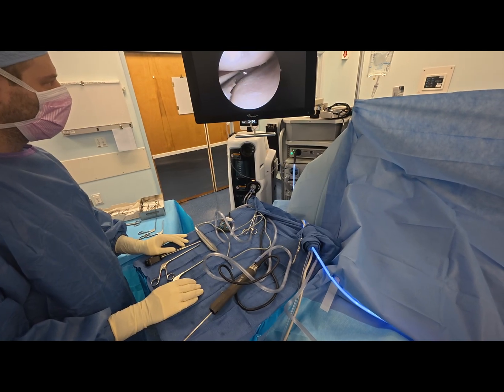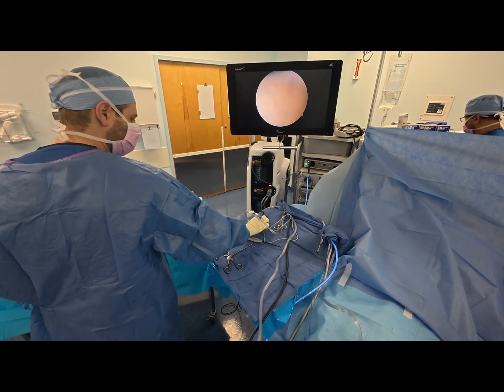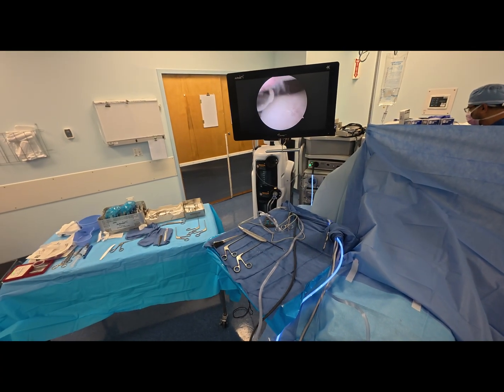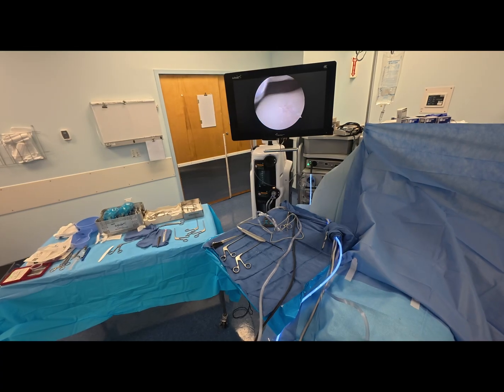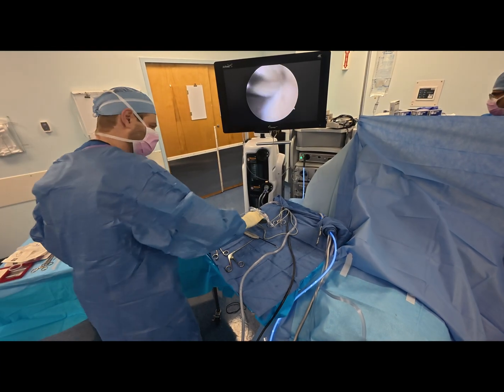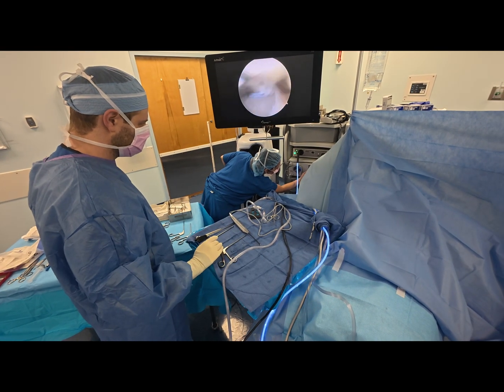This is all stable, one piece. Let's just look at the rest of the trochlea. And you can see that after I removed some of the synovial tissue, I could see some arthritis or chondromalacia of the trochlea.